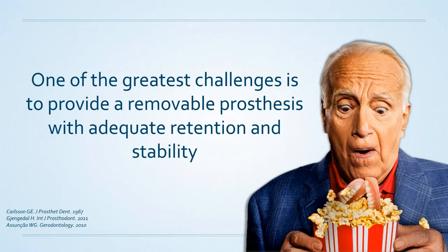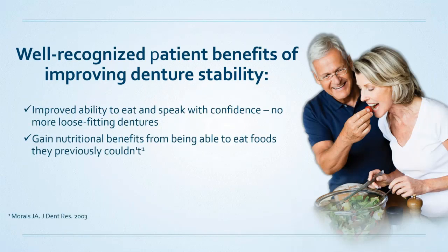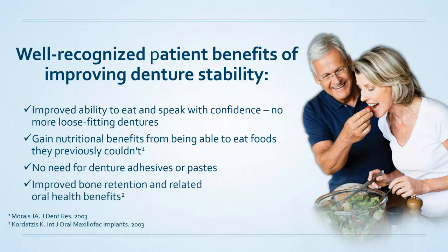so that way the patient has an improved quality of life. And we know that there are well-recognized benefits of improving stability of our patients' dentures. Improved ability to eat, speak, confidence, gain nutritional benefits, no need for or limited need for denture adhesives and pastes, and additionally improved bone retention and related oral health benefits. It's interesting too, because a lot of people think, oh, my patients don't think of implants as a way of preserving their jaw bones. They just think of an implant as something scary, and they have to do surgery on.